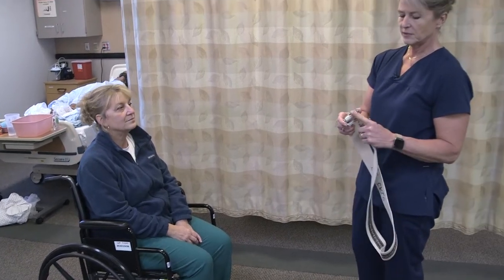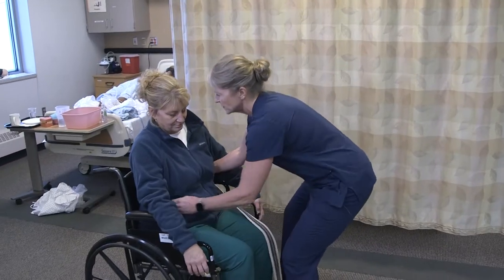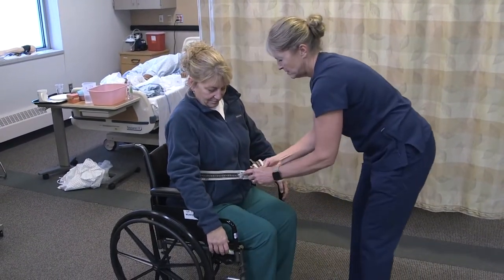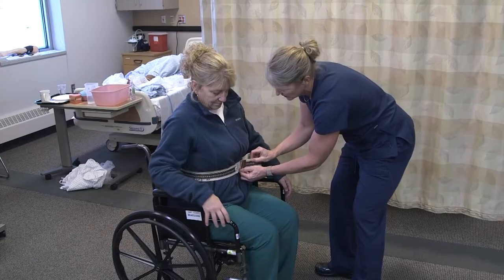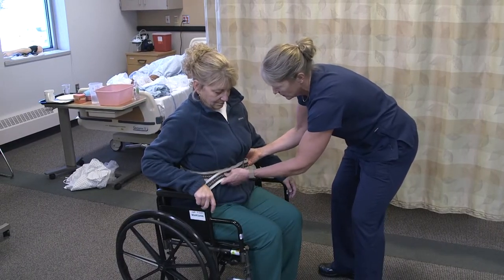Then we're going to put the gait belt on. We're going to look for the teeth and place that around her — if you can sit forward for me a little bit. Making sure for women that it's underneath their breasts and that it's comfortable. We want it to be fairly snug but able to get fingertips under there.